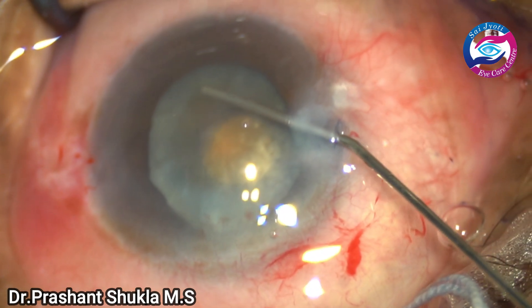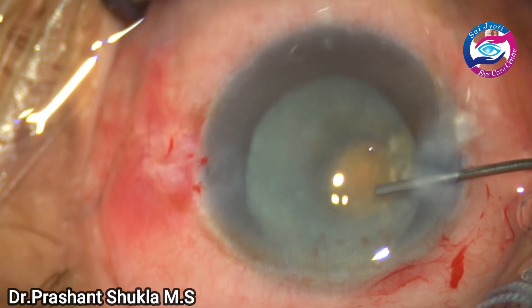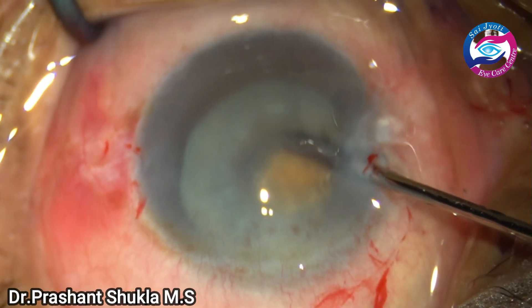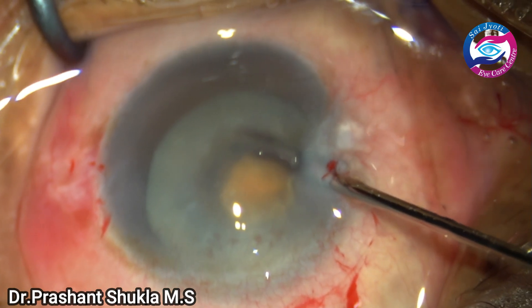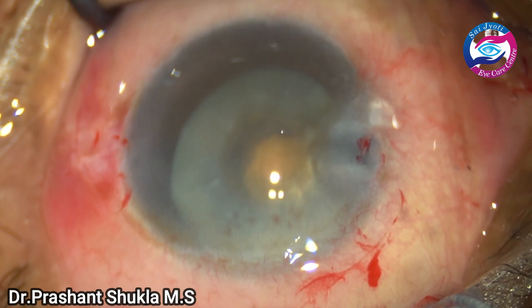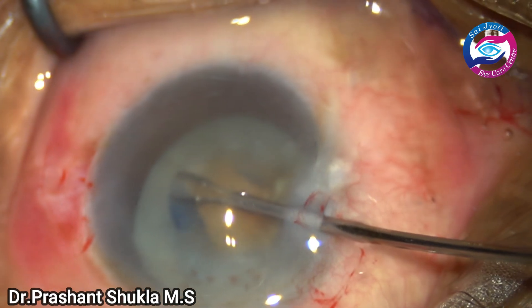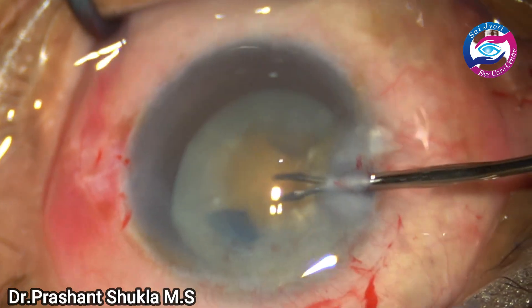After decompressing the capsular bag, I am going to enlarge the capsule rhexis again. The anterior chamber is filled up with viscoelastic, and a small micro scissor is taken to make a tangential nick in the anterior capsular margin. The zonular health is also not very good because when I made the nick there were some radial folds. So again I am taking the micro rhexis forceps to enlarge the existing capsule rhexis to the optimum size of about 6 millimeters.